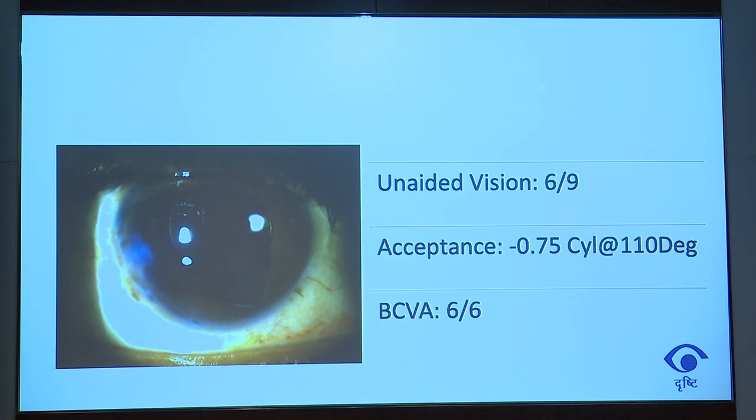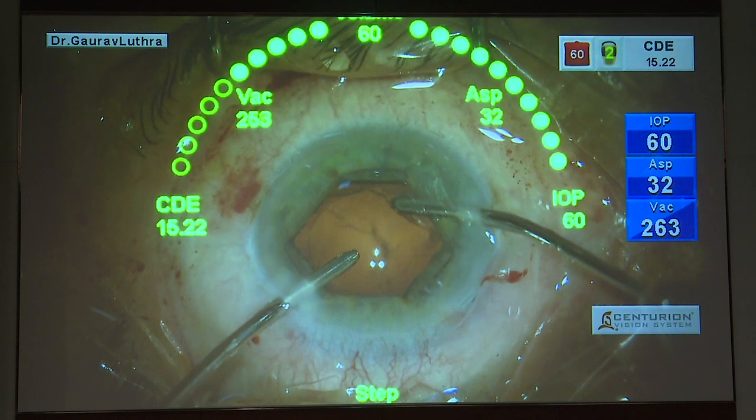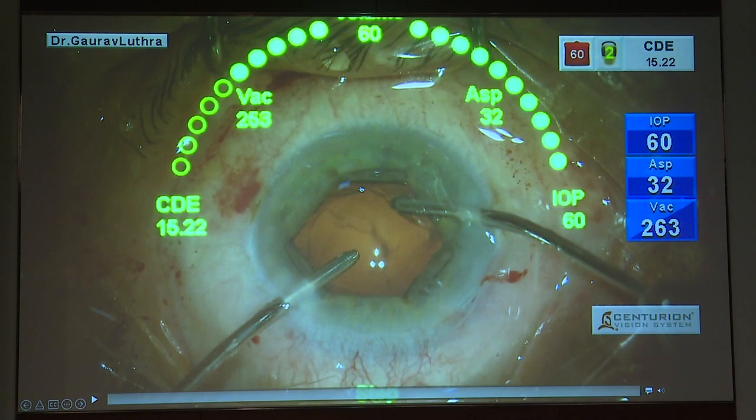So this was customized with Care Group, and they worked very hard. They were quite supportive because they gave 3-4 designs. The only thing is that I want to see long term, this is about a year old, how long the pigment lasts. That's probably the only issue which everybody thinks may or may not work. But I do have several patients with the aniridia ring, which also from Care Group, almost more than 15 years old. They somehow have still held their pigment. And I have no financial interest with them, but they are supportive in these areas.